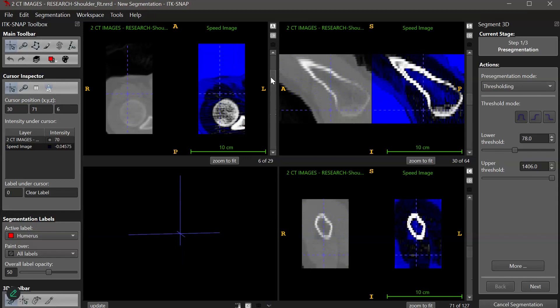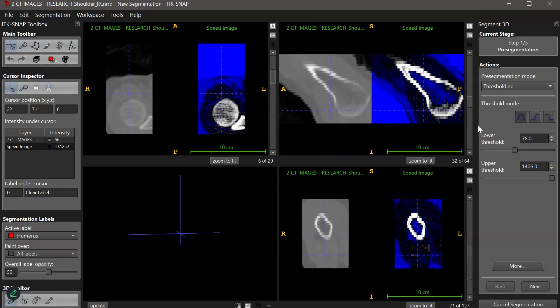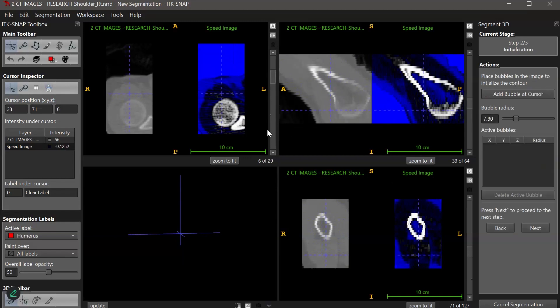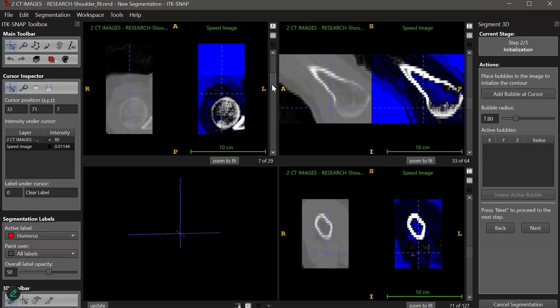In the speed image, I can see how my threshold is affecting these values. I want my intended features to appear white on the speed image. I want the pixels that shouldn't be included in the segment to appear blue. Any pixels that I'm unsure of will appear grayscale.